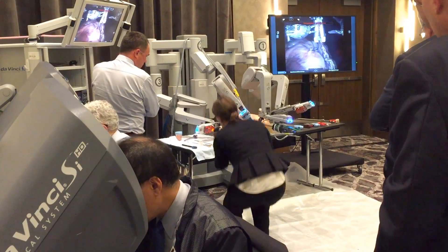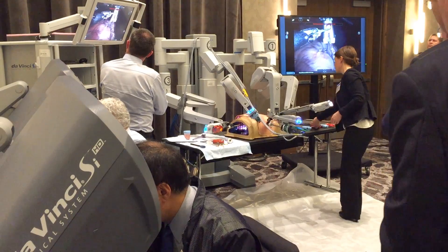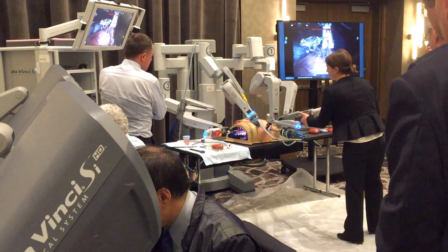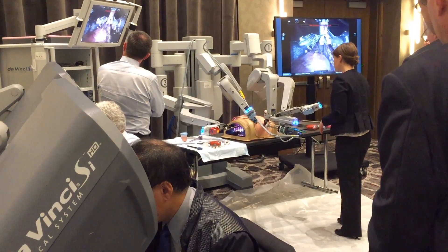We decided to really revamp the program to be one in which there's a large hands-on component. We will have cadavers, we will have pig hearts, and we are working on various simulation setups so that people will actually be able to sit down at the console and drive the robot. There will also be bedside responsibilities — who's tying knots, who's passing things in and out of the wound.